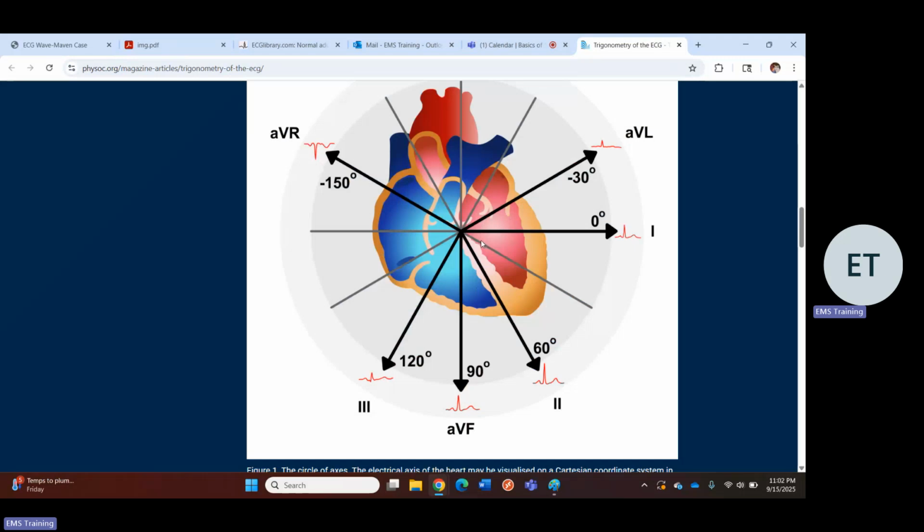That's in the absence of structural heart disease, some sort of cardiomyopathy, ischemia, or MI, or some sort of anatomical abnormality that the patient has, like a flipped heart. A lot of patients with lung disease have a change in the chest, the thoracic cavity size and shape. Because of lung disease, like hyperinflated lungs, the heart can rotate, so that will change the axis.